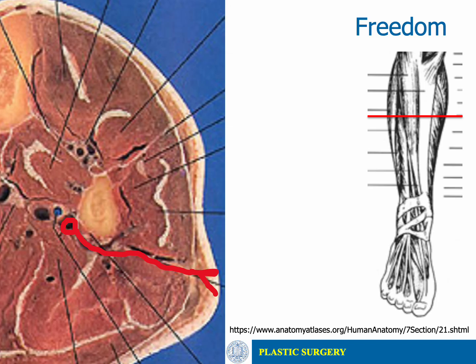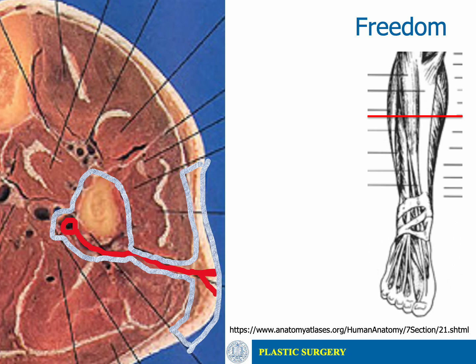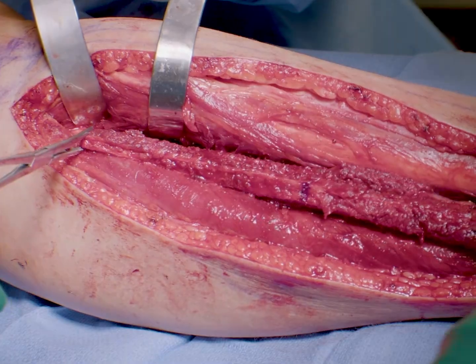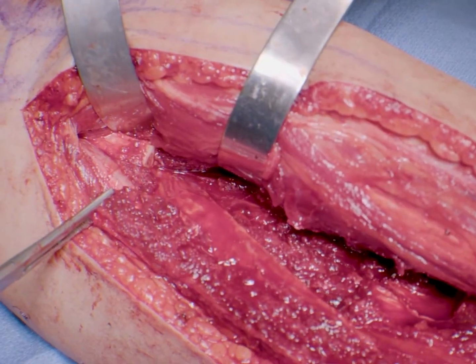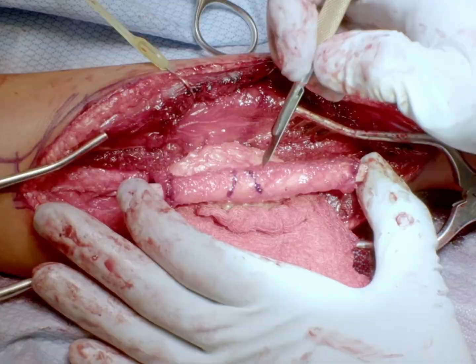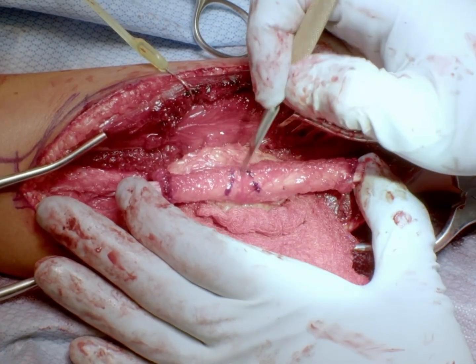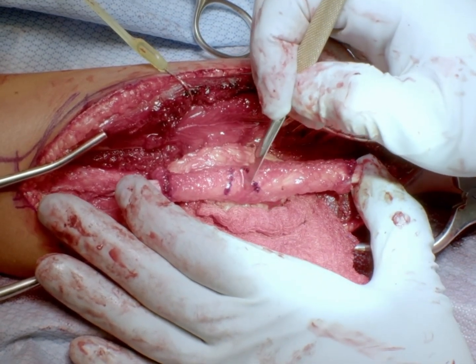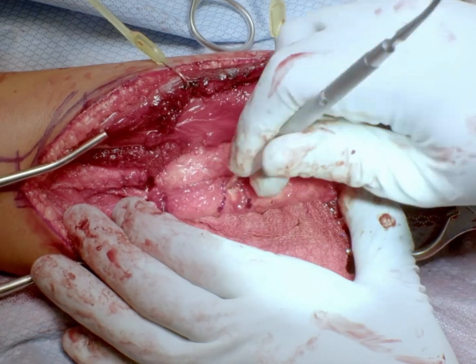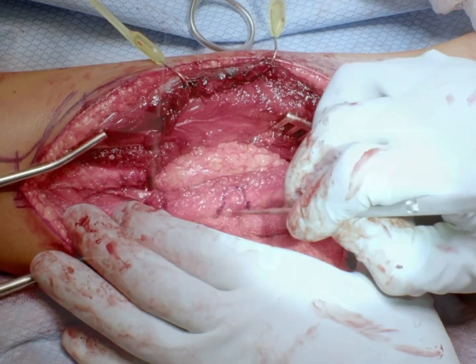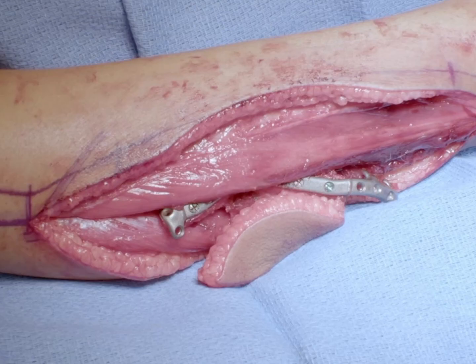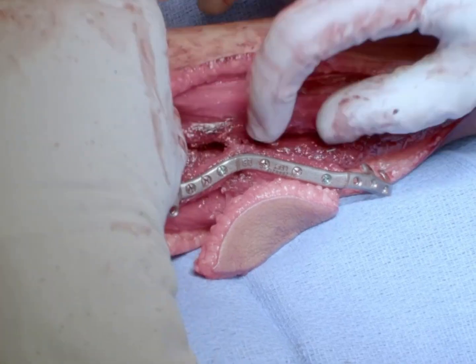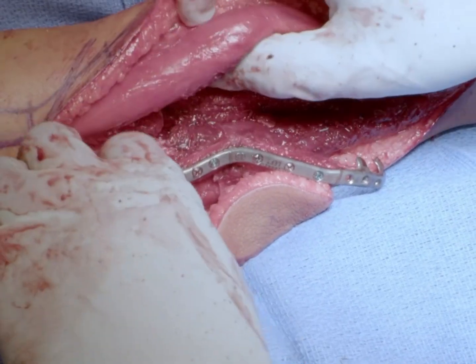The flap should now be fully free. If additional osteotomies are needed for custom reconstruction, subperiosteal cuts are performed to preserve the periosteum. Custom plating can be performed even prior to flap harvest.